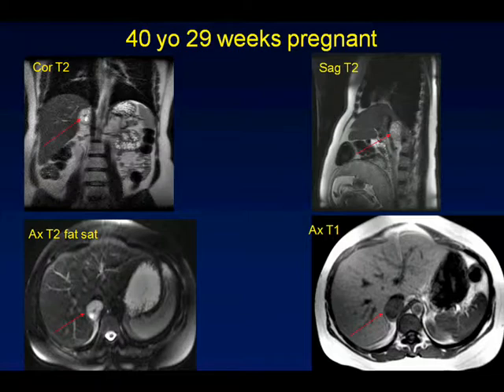And sure enough, when they did the urinalysis, it was 20 times normal. So this was a pheochromocytoma. And pheochromocytomas on MRI, some people describe it as a really bright lesion, and it's bright if it's cystic. But unfortunately, it's not specific. You still need to go with history.